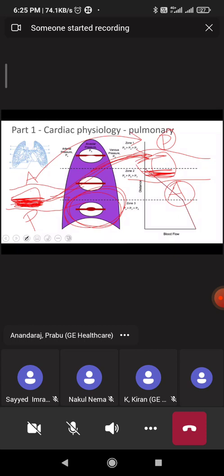Sir, in this situation, for the COVID scenario, this thing happened, right, sir? Yeah, you see, ARDS, they generally do it, and any patient who is having a lot of fluid in the lung and challenge, proning is advised.